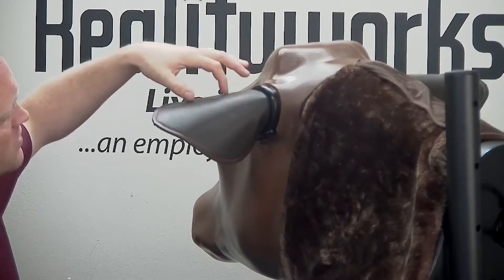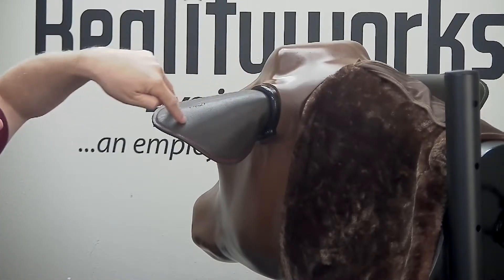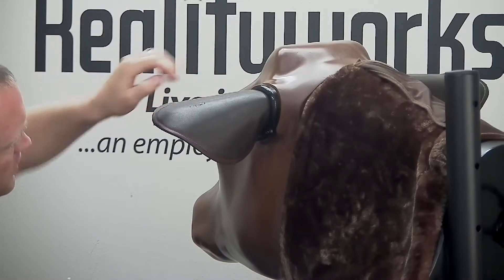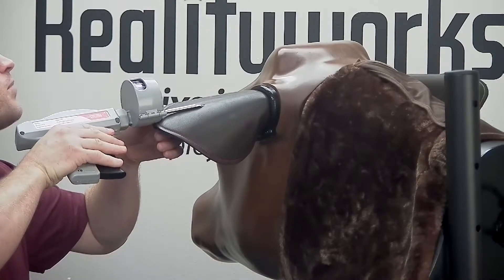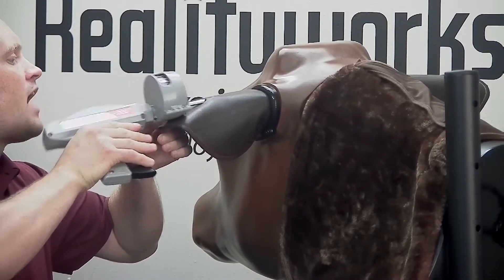Inject in the middle section — the middle third — between the cartilage. Be sure as you insert the needle that you do not stick it straight through, but keep it close to the surface. Poke and then push through, remaining at the top.